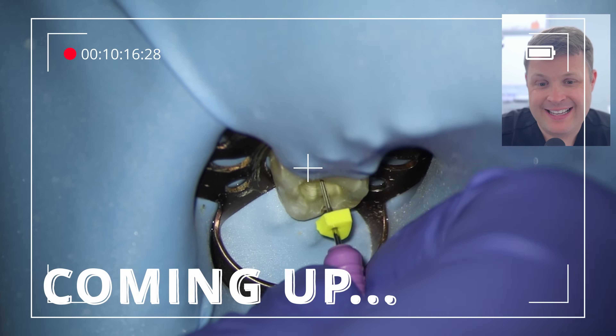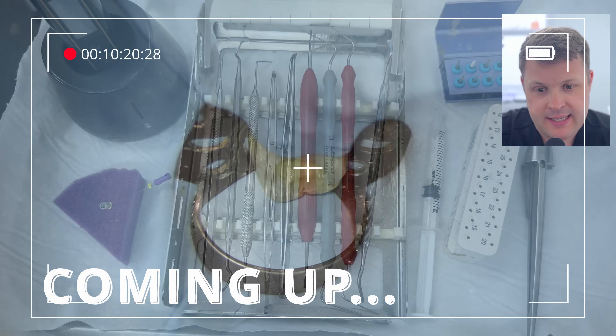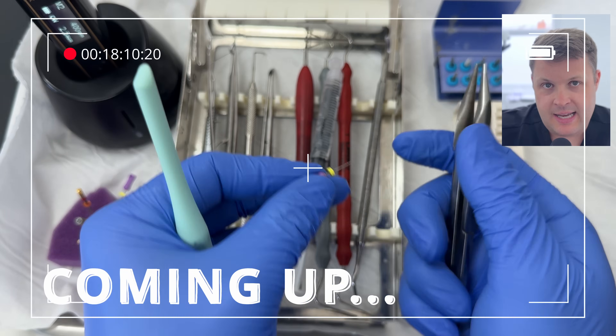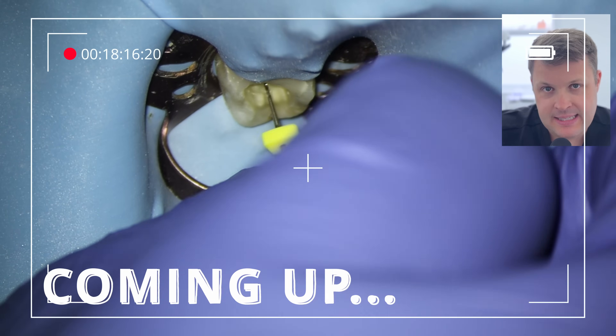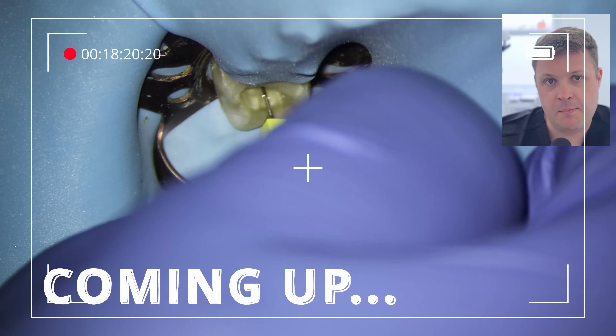With this size 10, I am not reaching as far as I did with the size 8. I've just got to keep my cool here and have another little go. I'm noticing with this size 10 that I am still getting quite stuck, and I'm slightly concerned here that I have patency. Last time I tried with the size 10 D-finder, I actually blocked the canal.